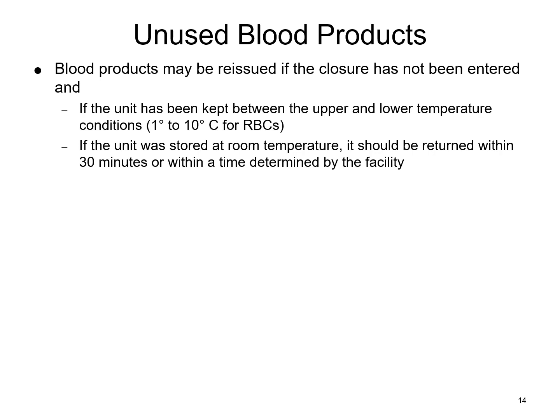product back into inventory. Your facility may have additional protocols that they can use, as far as maybe that there's some sort of temperature indicator on that unit, or you issued it in a cooler or something like that. So there could be other stipulations as far as the time frame that you issue it.